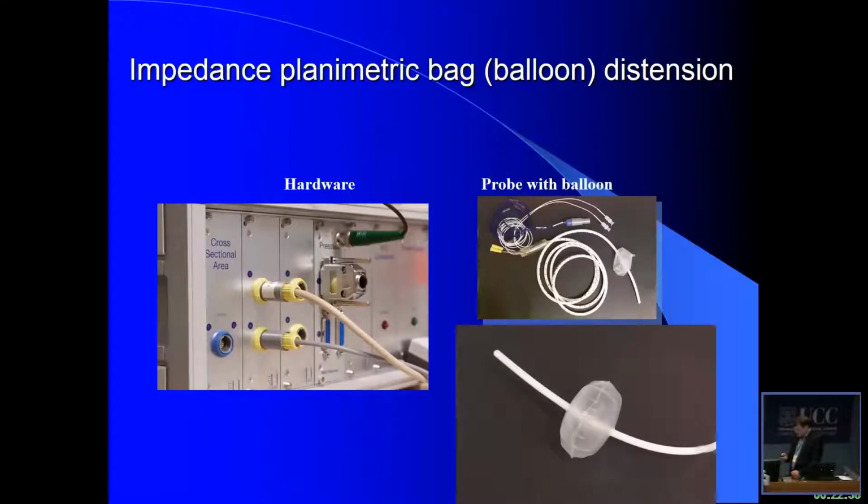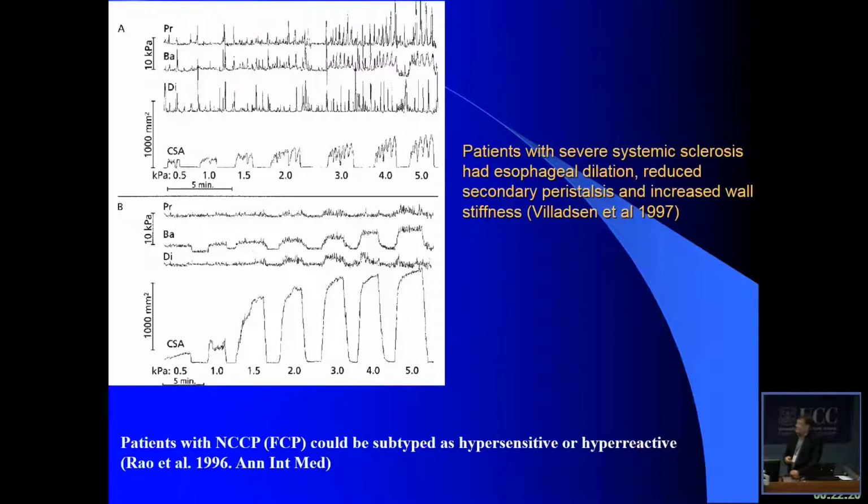And it was basically a system we built up in my group about 25 years ago. So we built the hardware, the software, the probes, everything by ourselves at that time. And it was used quite a lot as an independent technology by our group and with collaborators in the late 80s and 90s. And here are some examples from some of our clinical studies.